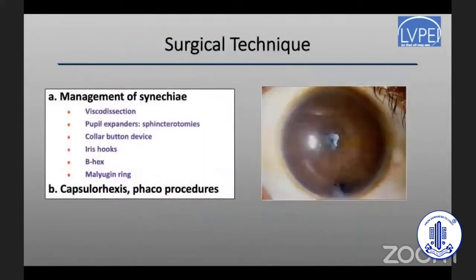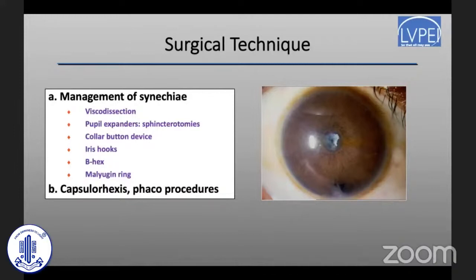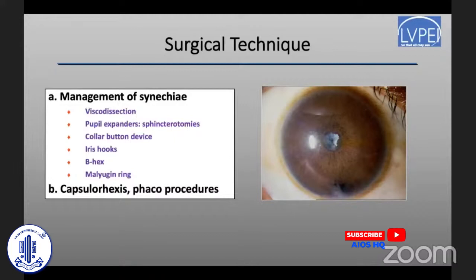The surgical technique consists of two important parts: management of the synechiae and the capsulorrhexis with the rest of the phaco procedures. Synechiae can be released by simple viscodissection in cases of very small or thin synechiae, but most of the time we have to use other techniques to expand the pupil — such as sphincterotomies using Vannas or micro scissors, collar button devices such as Gublin's hooks, iris hooks, and rings such as the Bhex ring or the Malyugin ring.